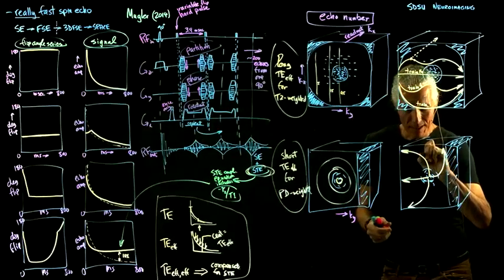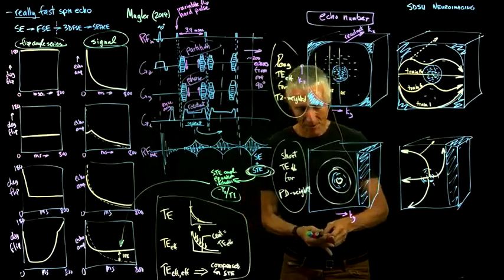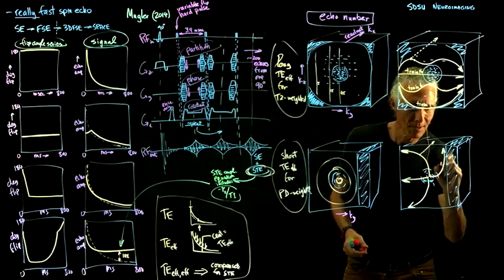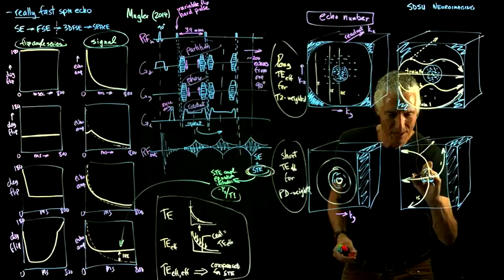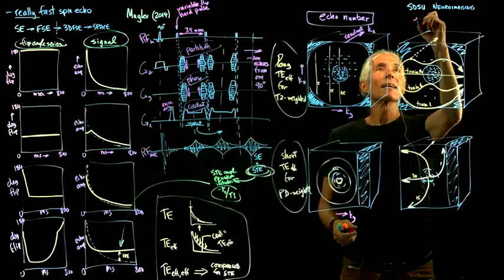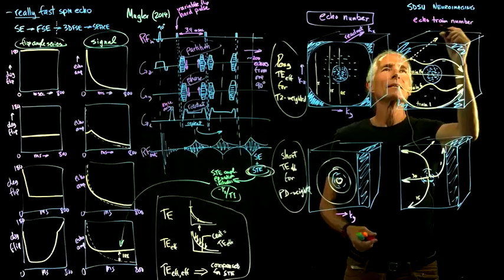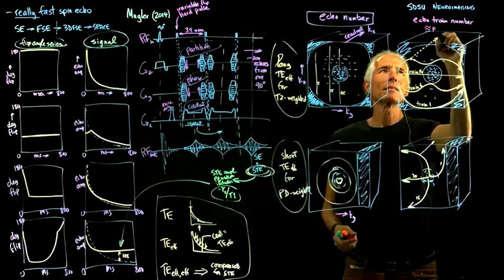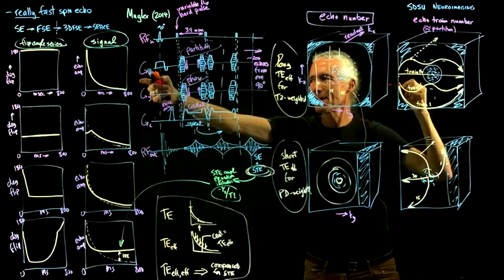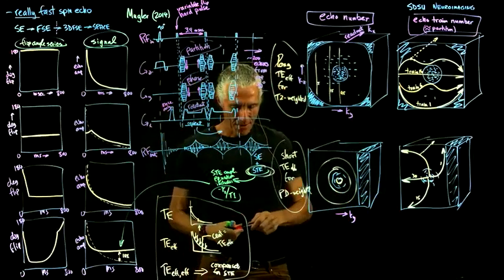and then once you get there, of course, at each one of these points, we then record our train of echoes. So these are the different trains of echoes. I think this is the first one. This is the 15th train and the 30th train. I didn't title this one. This was echo train number. So there's one of these for each 90 echo train number. It's sort of like the partition direction, but it's not, because it's a particular combination of GZ and GY that's not just going through in a simple loop fashion.